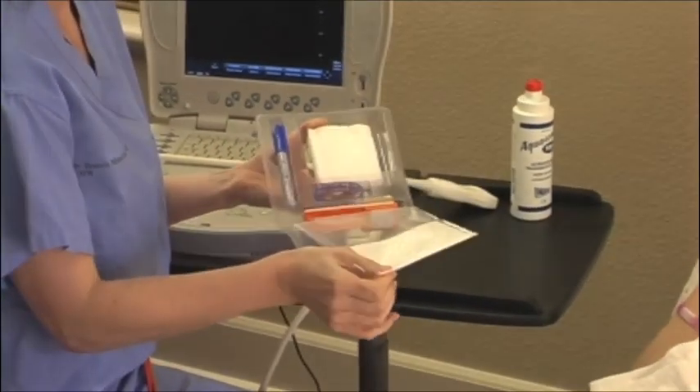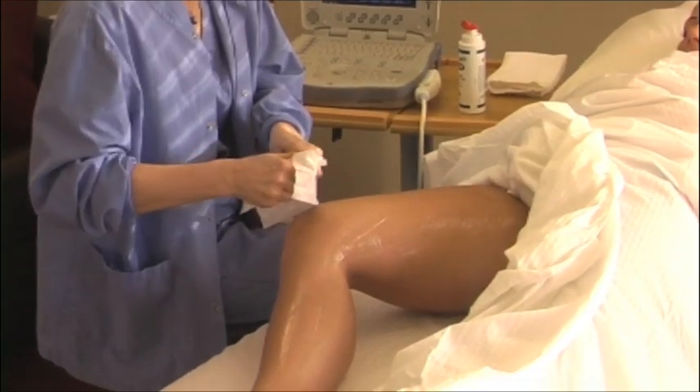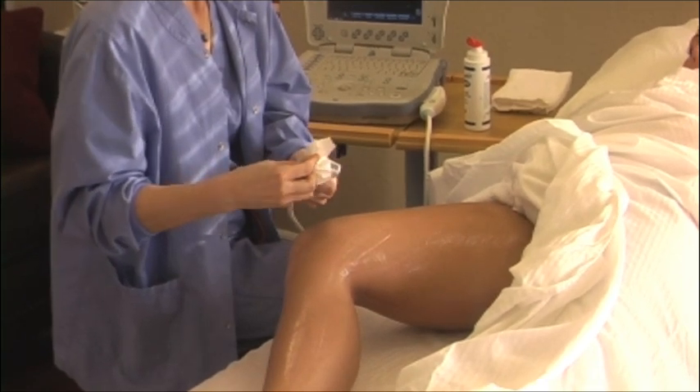Open the AIM Kit and have it available for use. Use a towelette from the AIM Kit to thoroughly remove the coupling gel from the transducer.